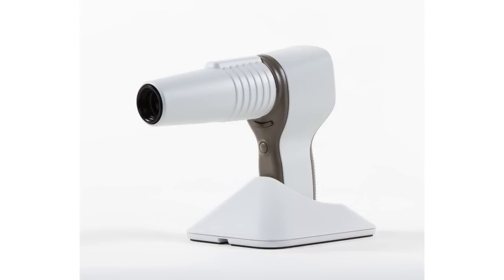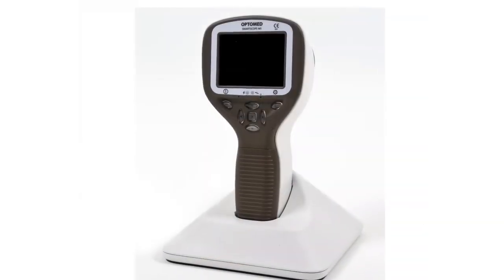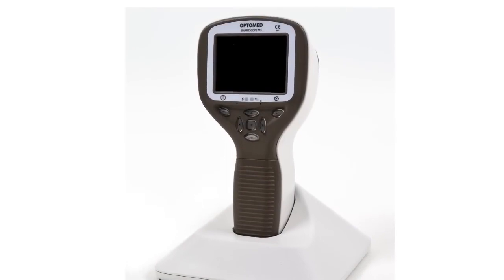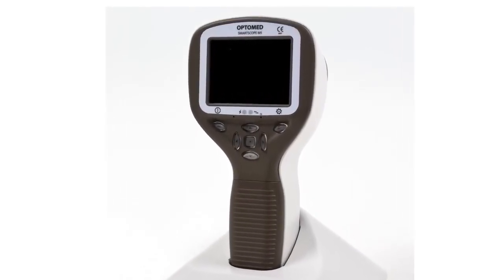SmartScope M5EY3 is a handheld digital retinal camera that enables non-mydriatic eye fundus examination and documentation of patient data through digital images and video.